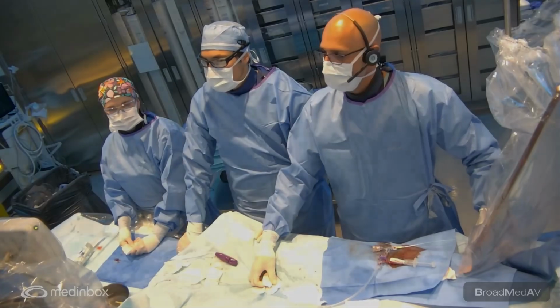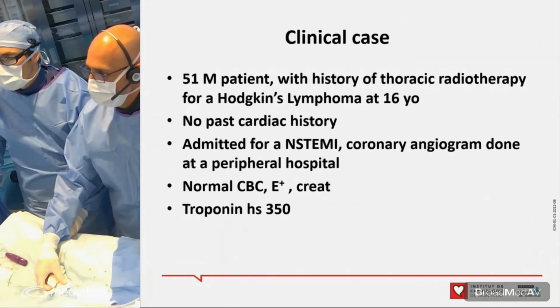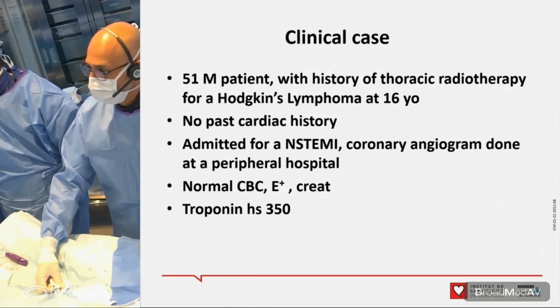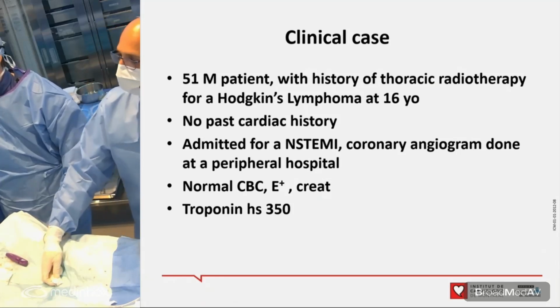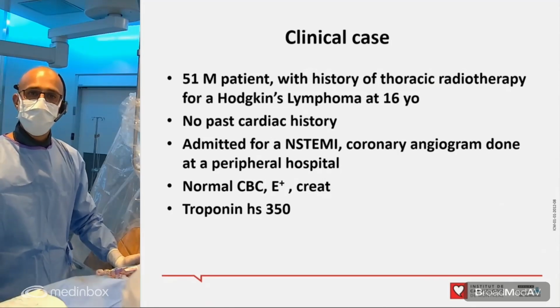So we have a great case for you today. We'll demonstrate many things. This is a multivessel PCI case in a radiation-induced CAD. So we have a 51-year-old male patient with a history of thoracic radiotherapy for Hodgkin's lymphoma at age 16.